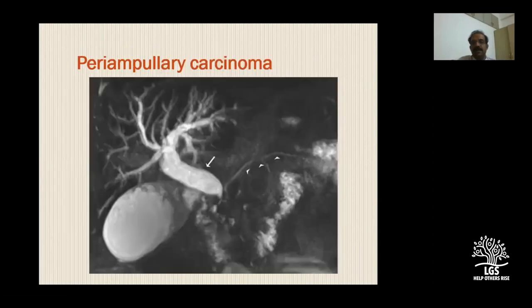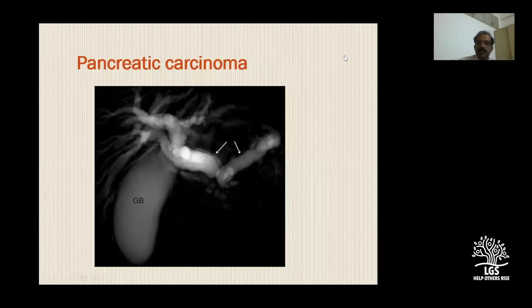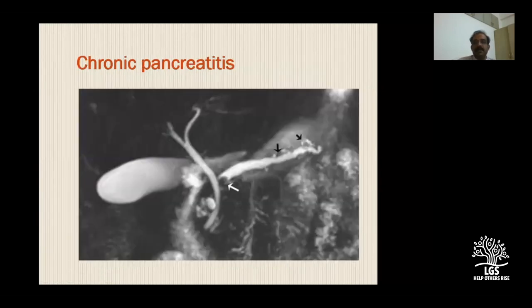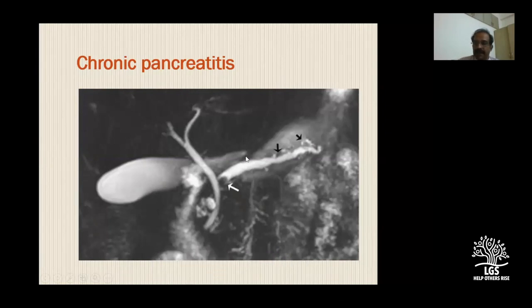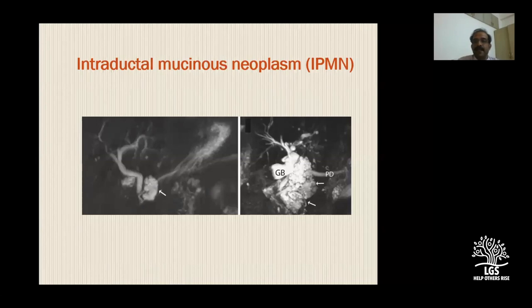For peri-ampullary carcinoma, you have a dilated CBD and intrahepatic biliary radicals while the pancreatic duct is normal - this pattern should raise suspicion. In pancreatic carcinoma, the classic double duct sign is well demonstrated on MRCP. In chronic pancreatitis, you get a lot of stricturing with irregular branch ducts, narrowing, calcifications, and calculi within the pancreatic duct - the duct is also dilated - which together with other sequences helps in the diagnosis.